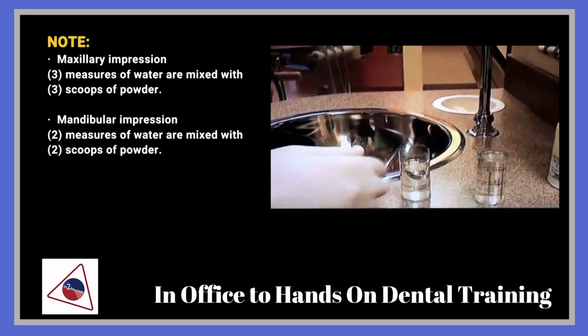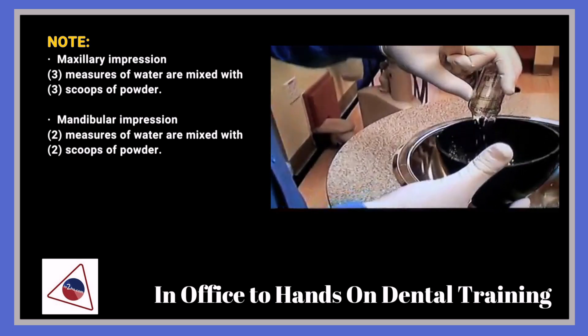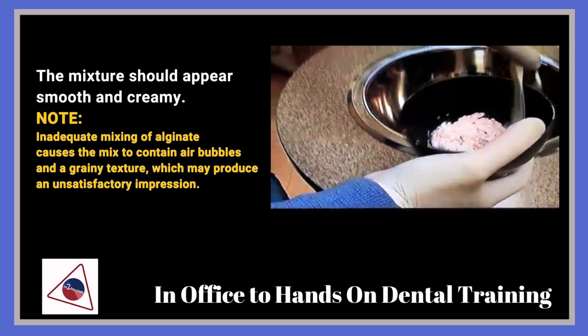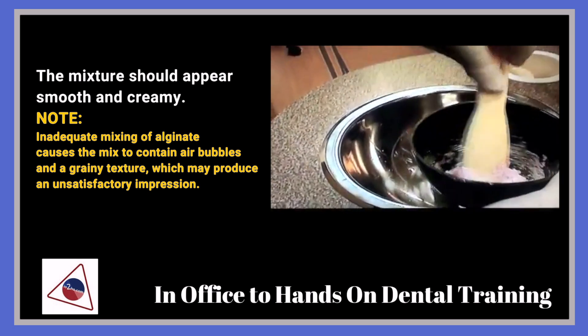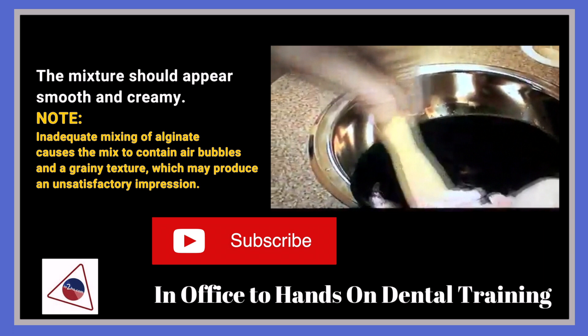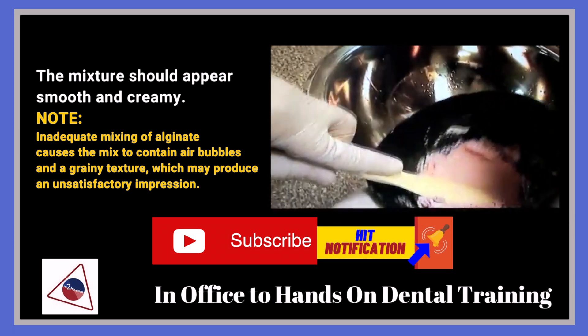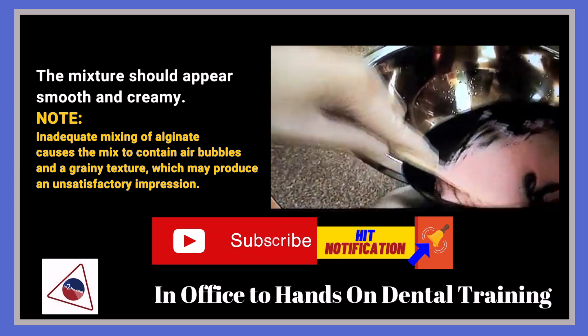When you mix this, make sure that you thoroughly incorporate the water and the powder. You've got to go fairly quick here because this is a fast-setting material.